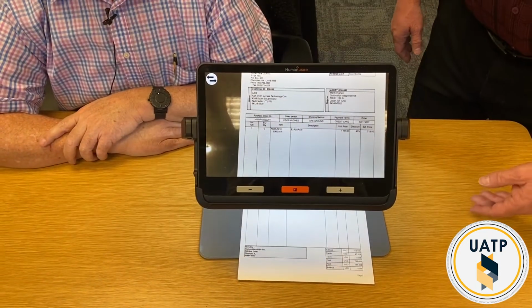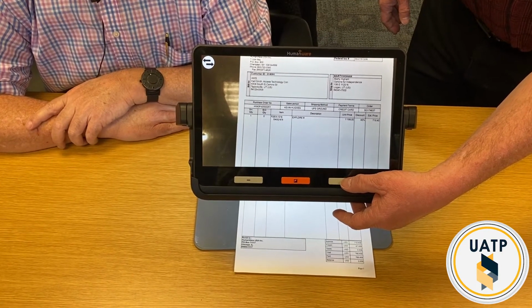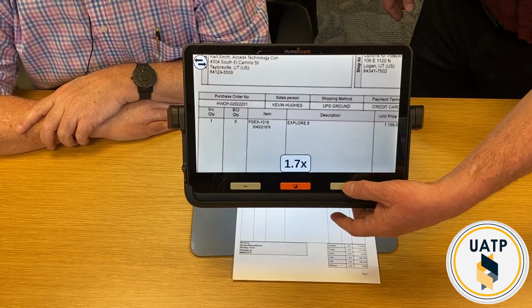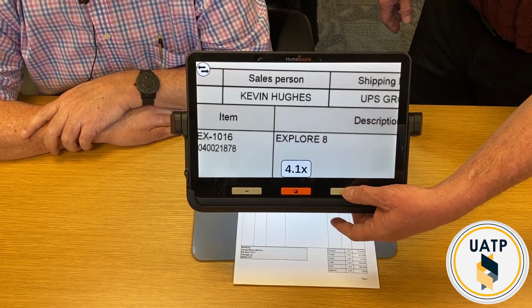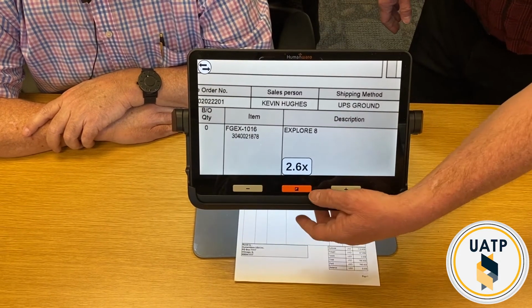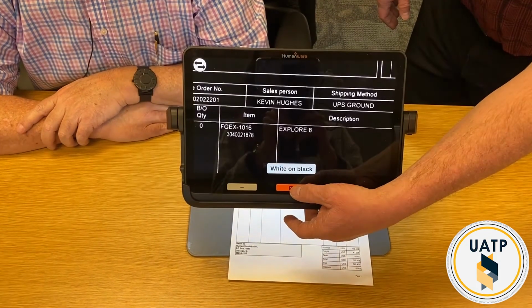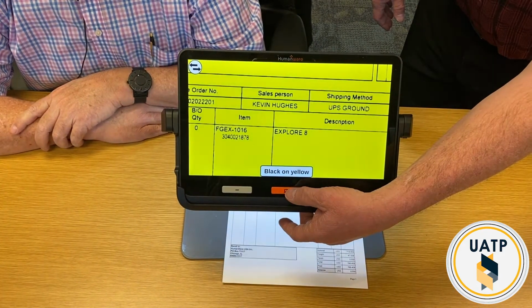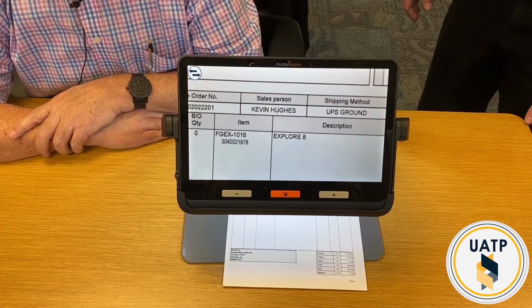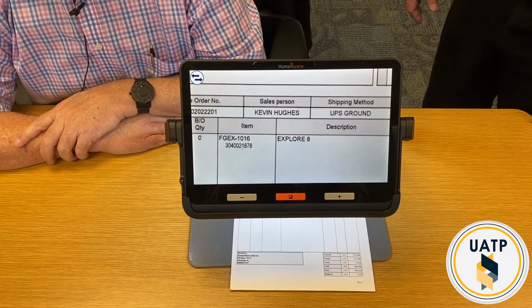On the left side, as you're looking straight at it, is the down magnification button, or the down arrow. To the right, on the far right side, is the zoom in button. And as he presses that, you'll see it makes the print larger and larger. Press the left button, it makes it smaller. The button in the middle is the one that selects the different colors. And you just tap it each time you want to change colors. And that way you can decide, because different things that you get might be easier to see in different colors. You might get a document that has a different color background or whatever.